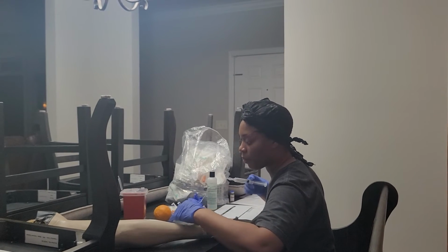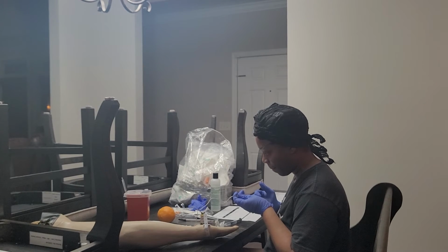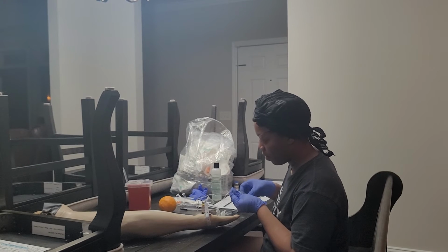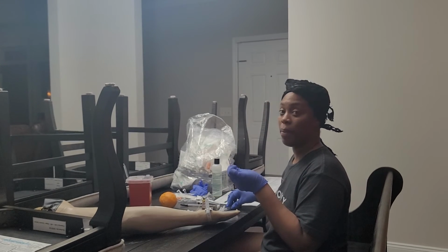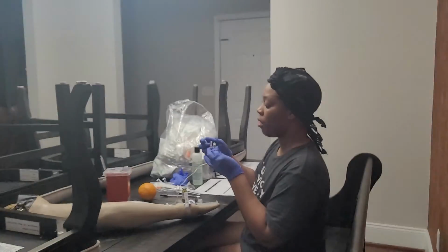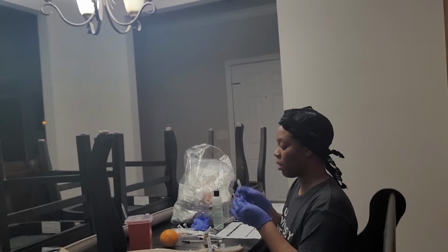3 mLs. I am going to actually pull off, and I'm going to put that in a sharps container.